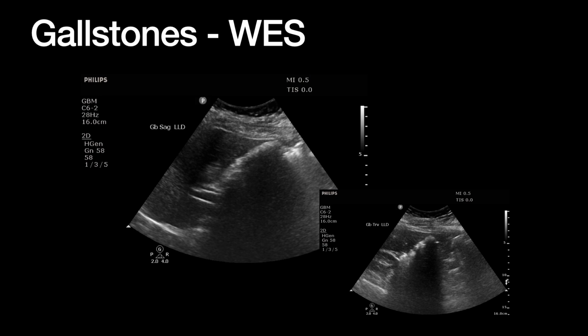And so what I found to be particularly helpful here is, again, look for that shadow. Normally, if you have a contracted gallbladder and just loops of bowel kind of filling its place, you should have kind of this dirty shadowing, right? Everything should just be kind of this mid-block gray, right? As you scan through someone who's got a wall echo shadow, you really have to know your landmarks, right? Your FAST exam view, you'd go just anterior to that. And all of a sudden, you just have this black hole, and not even black hole, just black smudge, and you think, I don't know what this is. It's just completely black on my screen. That probably is your wall echo shadow sign, right? And you're seeing in long axis that anterior surface of the gallbladder and then just shadowing deep to that, right?